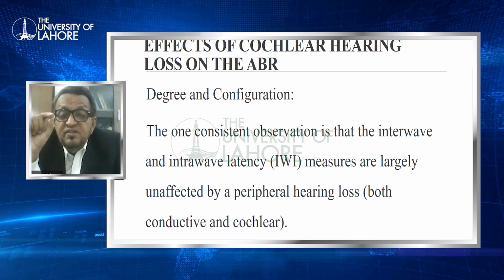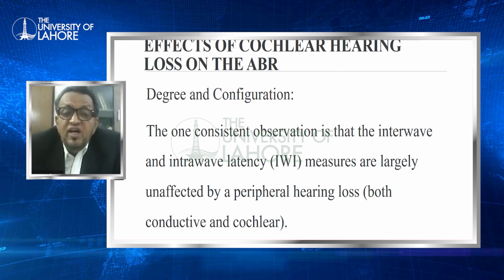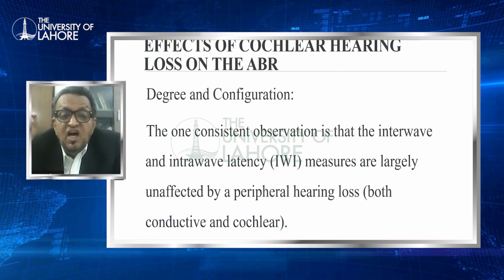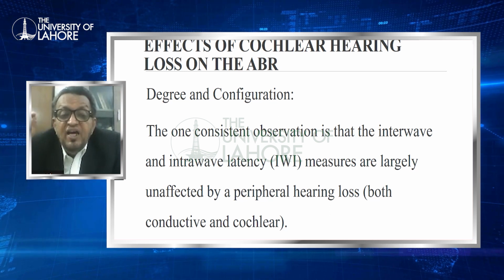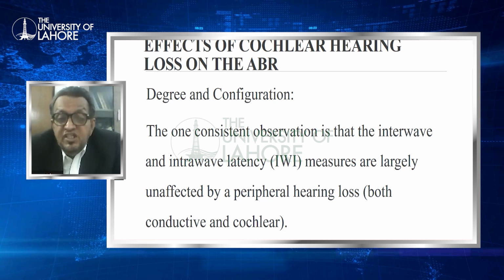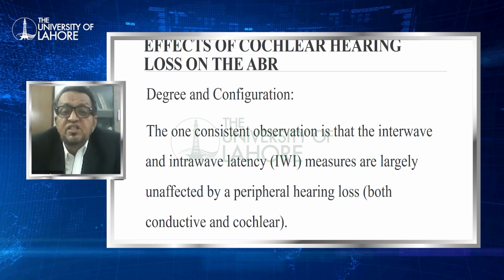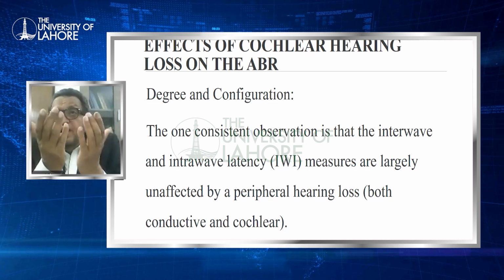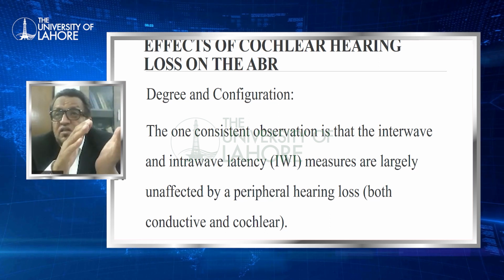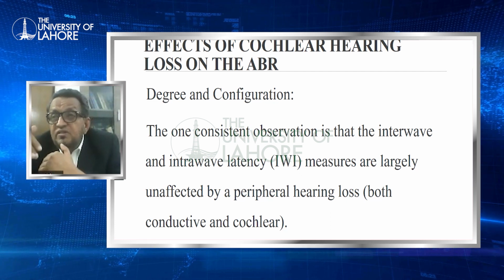The consistent observation in cochlear hearing loss is that intra-wave latency measures are largely unaffected by a peripheral hearing loss, both conductive and cochlear. Interwave and intrawave latency measures are largely unaffected. This is the crux of the matter. The normals and cochlear hearing loss, although intensity will be different.